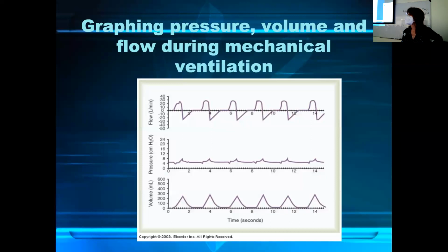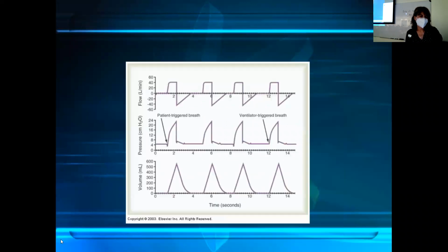Another question, Thomas? No, I'm still a little confused with that. Tell me what you're confused about. You're saying that exhalation starts at the very bottom corner, but then you're saying exhalation starts at the slope at the top. It's all the same point on the time. So exhalation doesn't start at that bottom corner, it starts at the top slope, right? Let's use this one. So at this point is when the exhalation valve opens, and instead of the air going into the lungs, now the air is coming back out of the lungs.